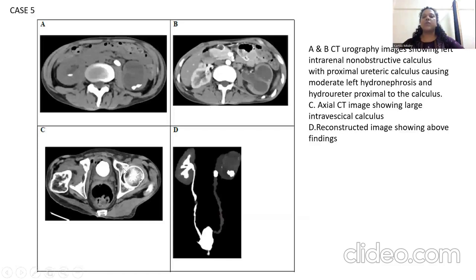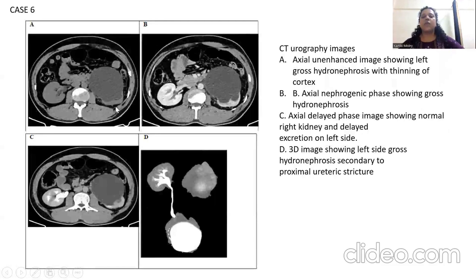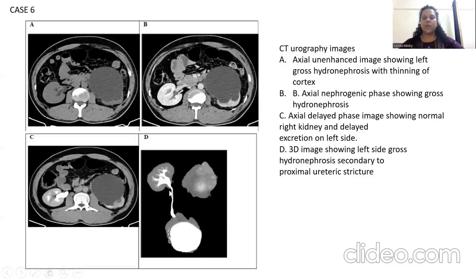The reconstruction image shows bilateral multiple intrarenal calculi of variable sizes with mild left hydronephrosis secondary to the distal ureteric calculus. Case number five is the CT urography image showing the left intrarenal non-obstructive calculus with proximal ureteric calculus causing moderate left hydronephrosis and hydroureter proximal to the calculus. Image C is the CT axial image showing a large vesical calculus, and Image D is a reconstructive image showing the above findings. Case number six: CT urography images showing left gross hydronephrosis with cortical thinning, and the 3D image showing left-sided gross hydronephrosis secondary to a proximal ureteric stricture.